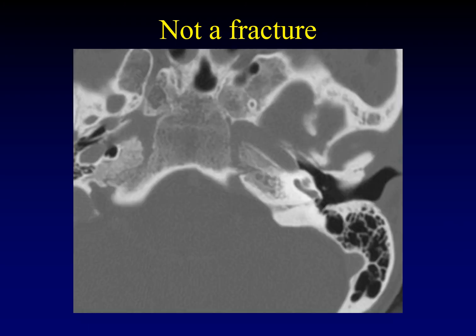Here's another normal structure not to mistake for a temporal bone fracture. This lucent line runs parallel to the internal auditory canal, slightly more inferior but along about the same course. This is the cochlear aqueduct, heading toward the basal turn of the cochlea. Like the vestibular aqueduct, it helps recycle endolymph and perilymph. This is a normal anatomic structure, not a fracture.